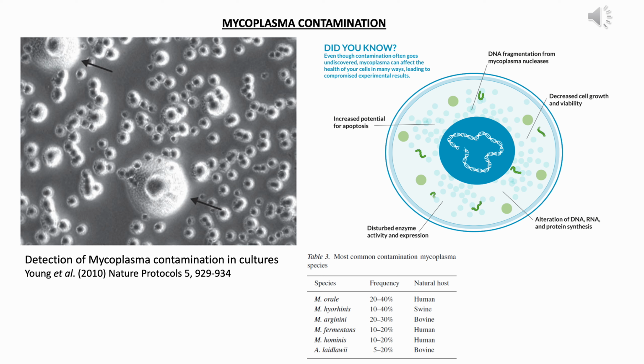What has been established at a particular concentration, for example detection of a certain protein: you stimulate the cells, and after 4 hours or maybe after 8 hours the RNA levels are increasing, and you know that after 24 hours the protein is increasing. Nowadays you are seeing, earlier at 24 hours you found a 4-fold increase in the protein, and nowadays you are only seeing a 2-fold increase, or you have to incubate it longer to see the same effect. Okay, so sometimes we ignore these things and we change the conditions to the new conditions and then continue doing experiments.